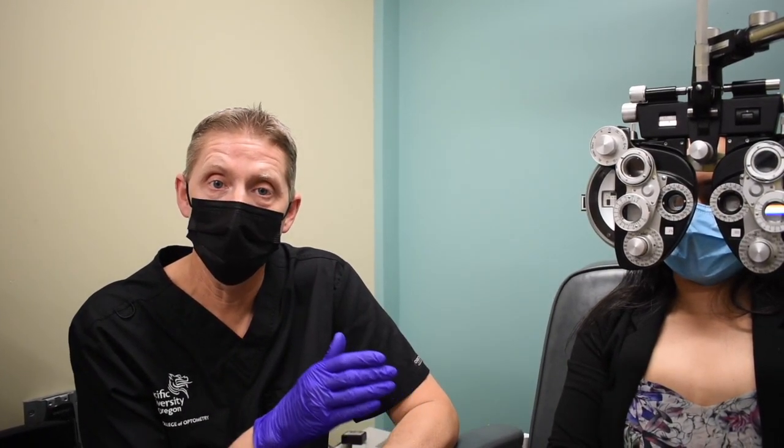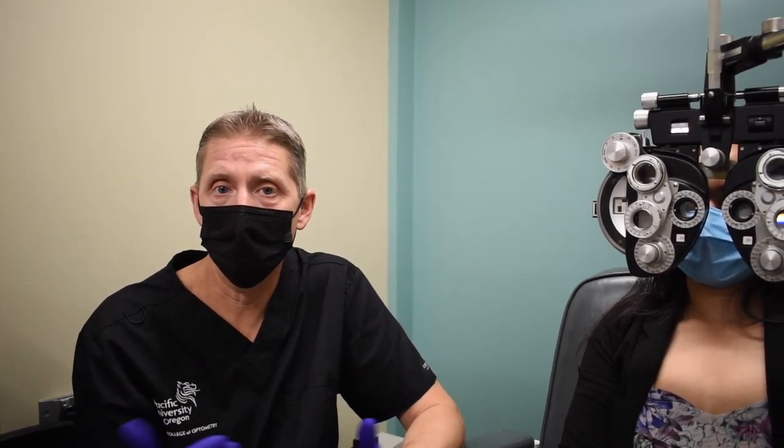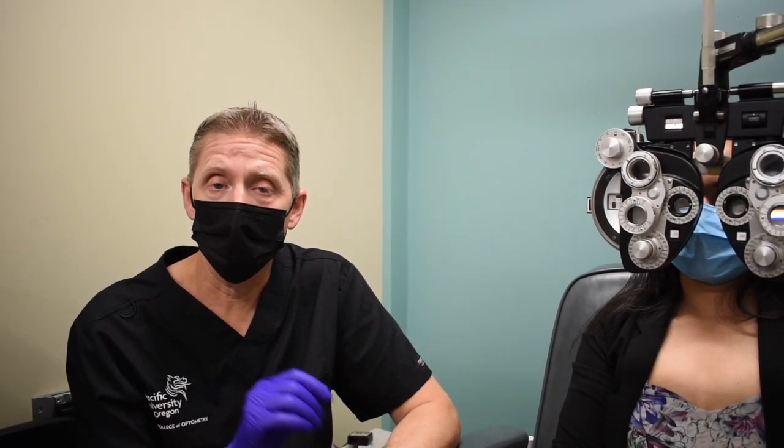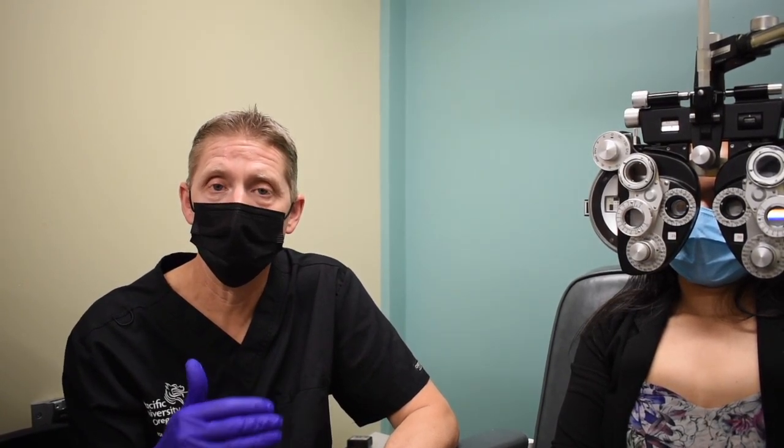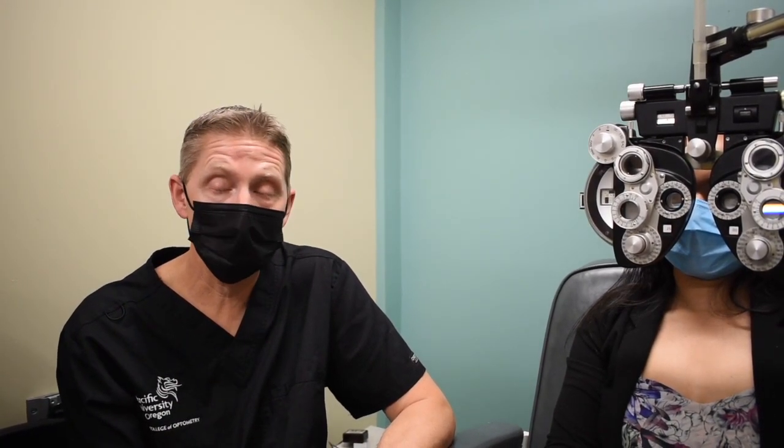All right everybody, so we're going to show you the sequence from retinoscopy all the way up through JCC. I'm not actually going to perform retinoscopy again, as you all know how to do that, however I'm going to pick right up with our first subjective spherical refinement test. We're going to show you how to do the bichrome, and for just expediency's sake I'm going to drop off the MSBVA at this point. Just know that if bichrome doesn't work for you in the refraction sequence because your patient isn't sensitive to it, you would sub in and do the MSBVA instead of bichrome.